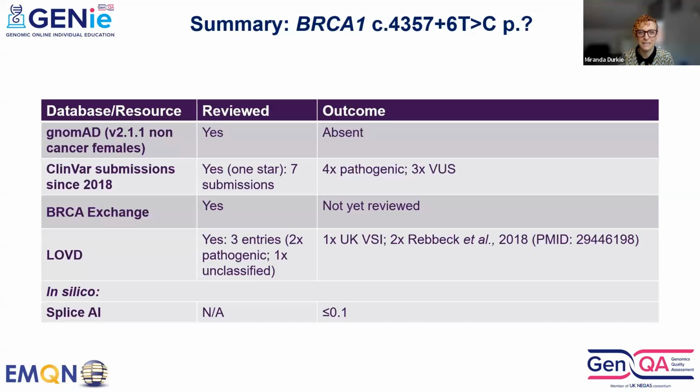Next slide, please. These are the common databases and resources we would always recommend checking. It is absent from gnomAD. It was present on ClinVar. It only had 1 star, but there are 7 different submissions, 4 pathogenic and 3 VUS. It is present on BRCA Exchange, but it had not yet been reviewed, so no classification was given there. Again, it was present on LOVD with 3 entries, 2 being pathogenic and 1 unclassified.